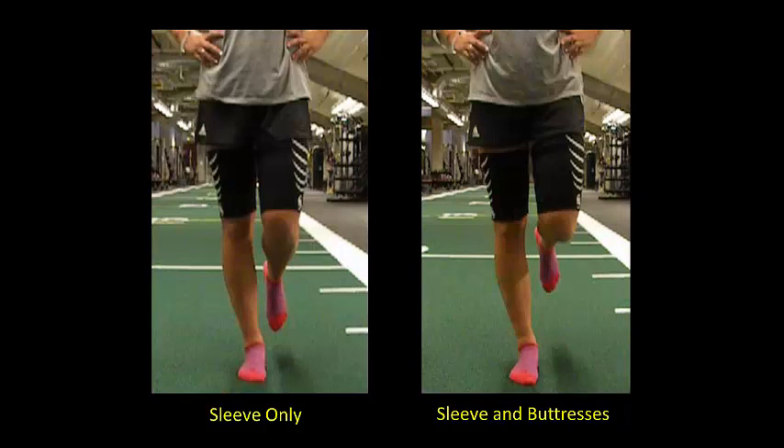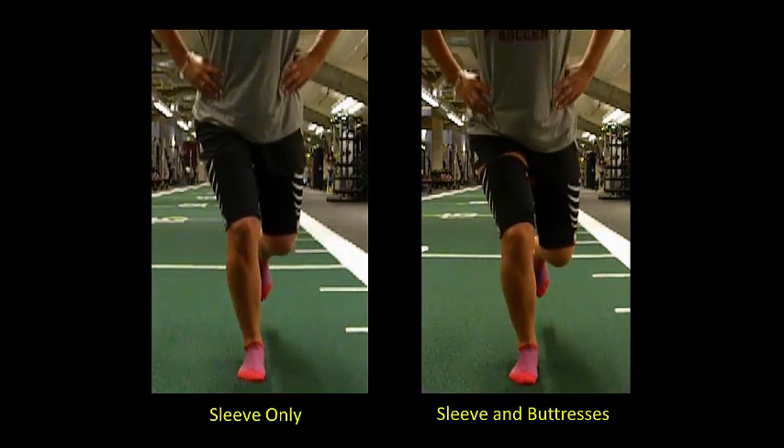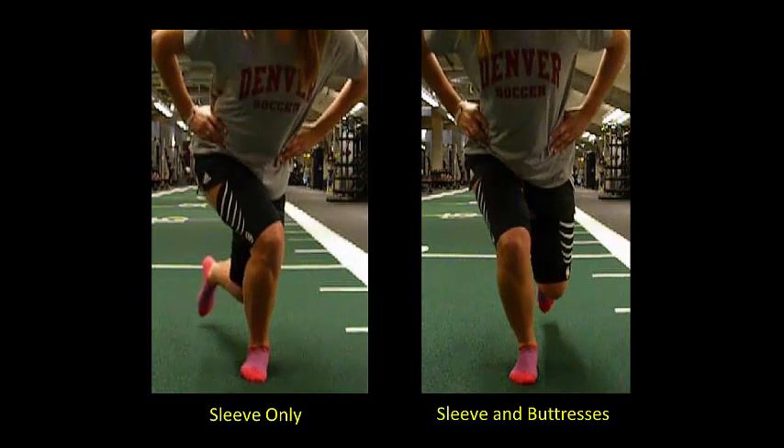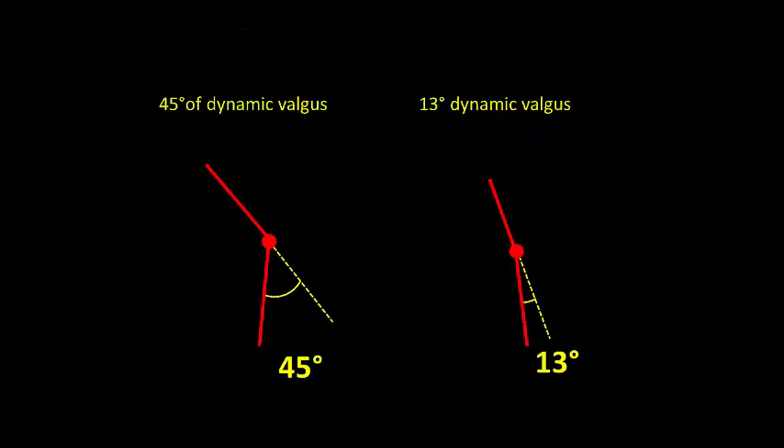On the left you can visualize the athlete's hips and knees rotating inwards in poor vertical knee alignment, whereas on the right, improved movement control and vertical knee alignment yields a 71% reduction in the dynamic knee valgus angle while performing with the buttresses in the ACL tube.